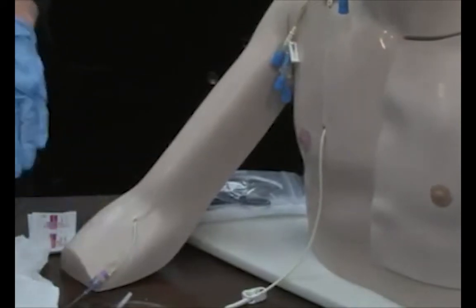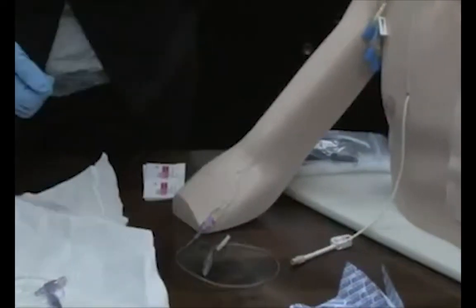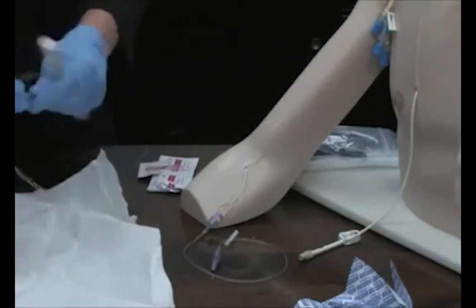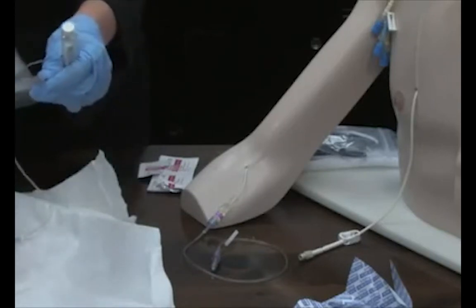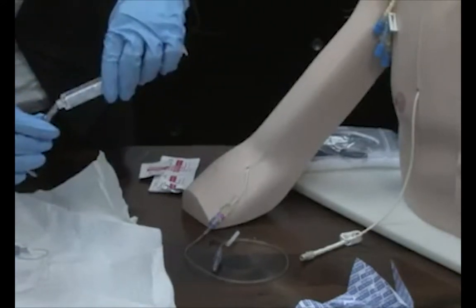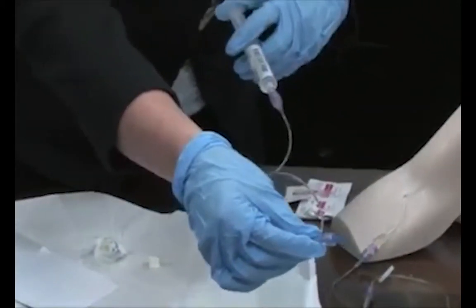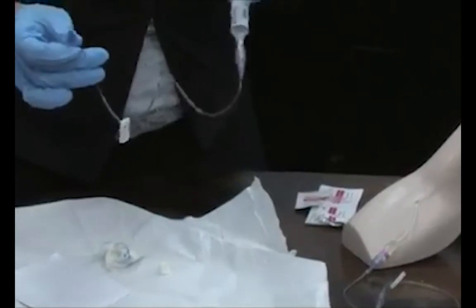Now let's talk about the extension change. So I have a dressing on this little guy right here right now. And I am going to use my saline, since that's been sitting to air. I'm just going to go ahead and, for caution's sake, you can never go wrong, cleaning the microclave well at the end. When you connect these two, it's just a soft push and turn. You don't have to do it too tight. And to prime, you're going to let a drop or so pull out. You don't have to remove this protective cap in order to prime the set. I've seen that a lot.